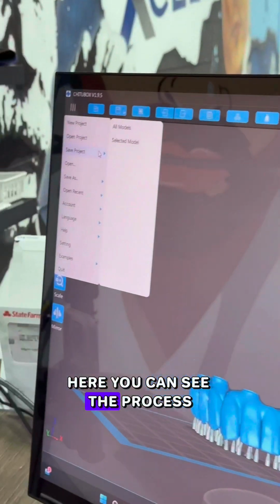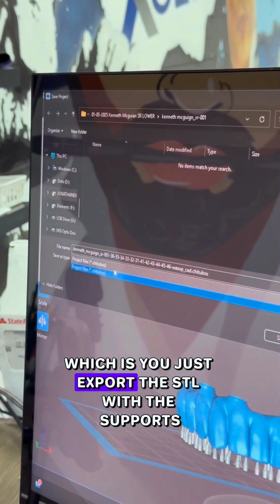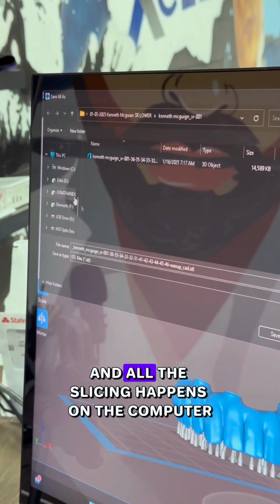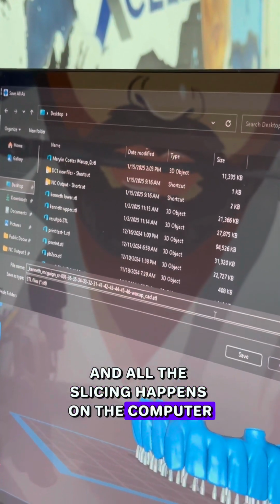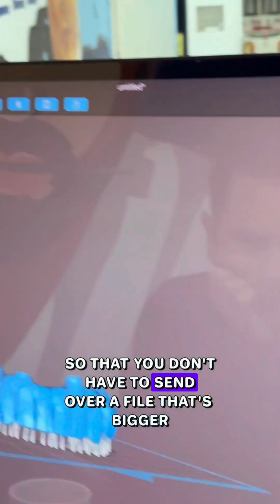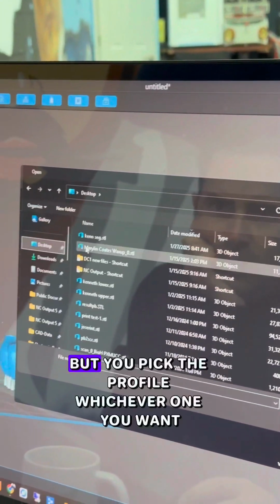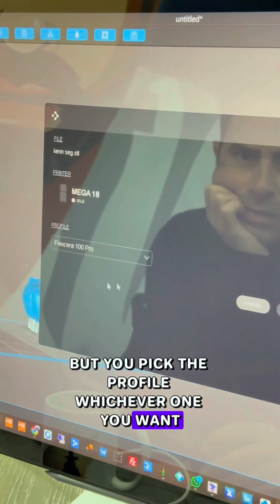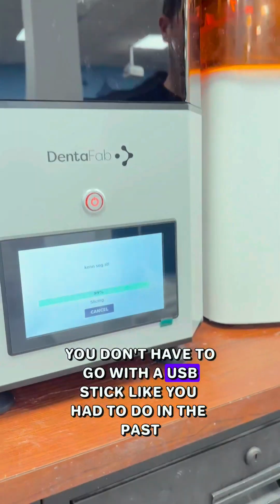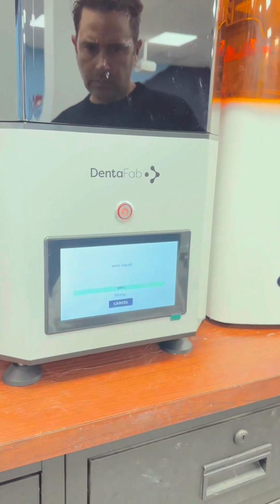Here you can see the process, which is you just export the STL with the supports. And all the slicing happens on the computer, on the printer, so that you don't have to send over a file that's bigger. But you pick the profile, whichever one you want. They're always updating them and testing it, which is really cool. And I like that it's all Wi-Fi. You don't have to go with a USB stick like you had to do in the past.